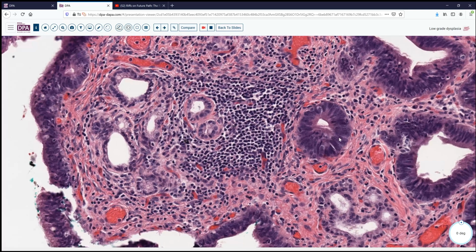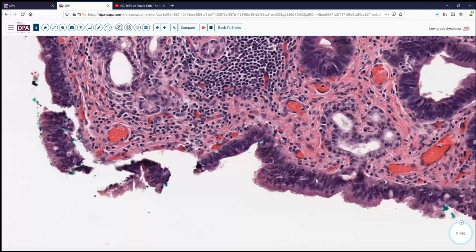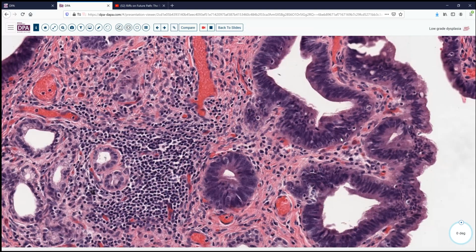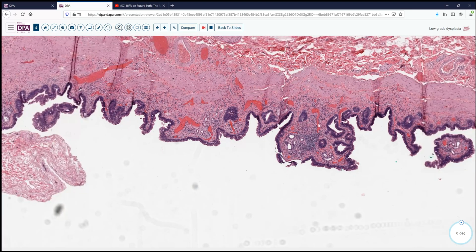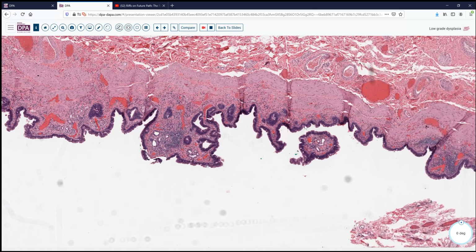And you can see that we get many of the typical features of glandular dysplasia with nuclear crowding, stratification, some karyorrhexis, maybe karyorrhectic debris, loss of polarity to some degree, and perhaps increased mitotic activity, such as you see here in these glands. Now, this is intestinal type metaplasia, of course, and dysplasia, and would be most commonly a precursor of intestinal type adenocarcinomas.